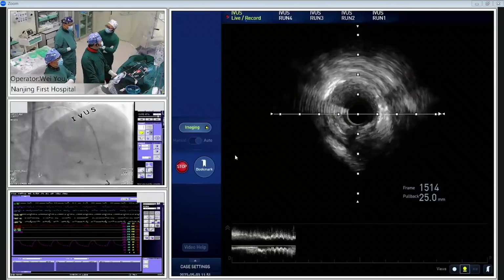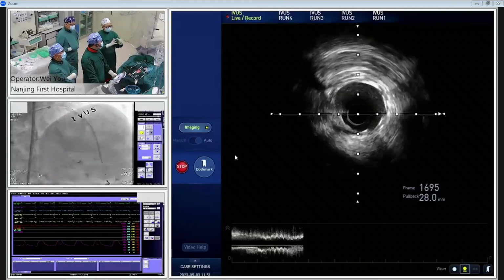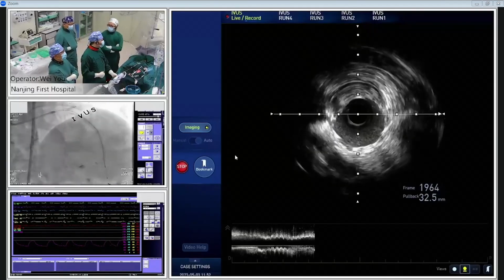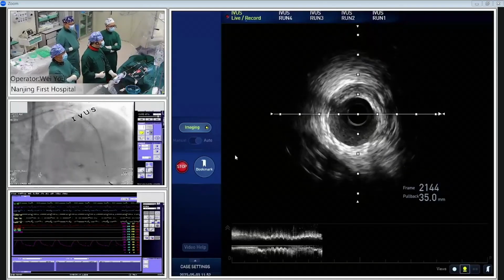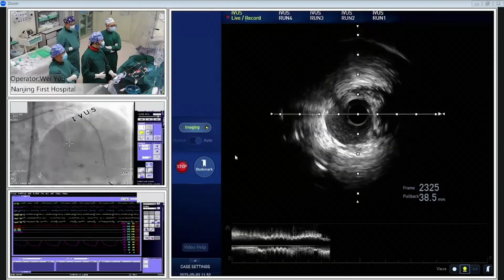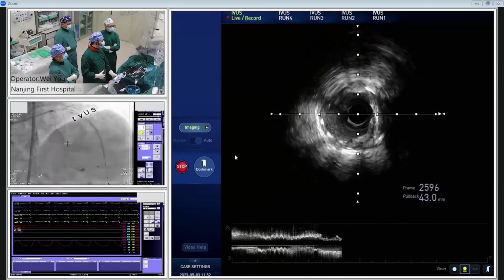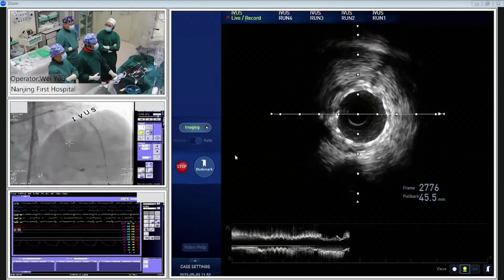So Chief, I have a question. Before we had IVL, we only had the big size burr for the big vessel, I mean, maybe diameter more than 3. What's your experience in lesion preparation for big size severely calcified vessels? Actually, this is a very difficult scenario. Before IVL was available, maybe 2 or 3 years ago, the only way of debulking we had in our cath lab, even in all the Chinese intervention community, was rotablation. We have a largest burr of 2.0. Sometimes it is very difficult for big size vessels.